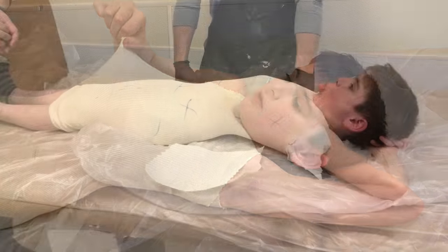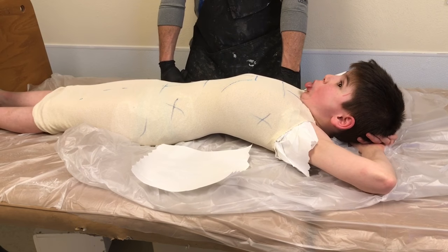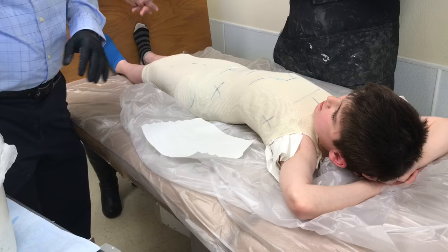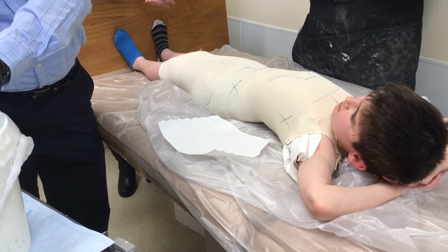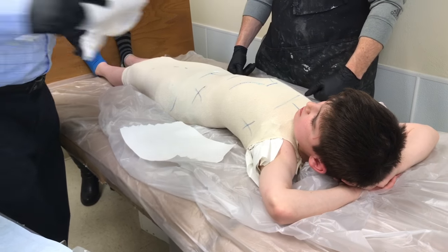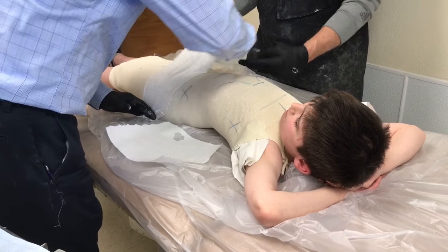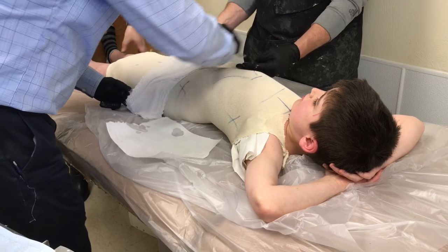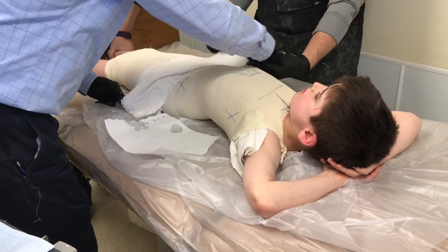Don't pull it, honey. Right arm towards the wall. It'll just feel like it's just laying there. There we go.